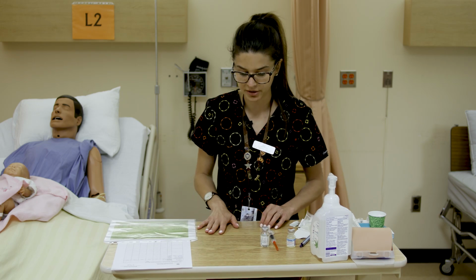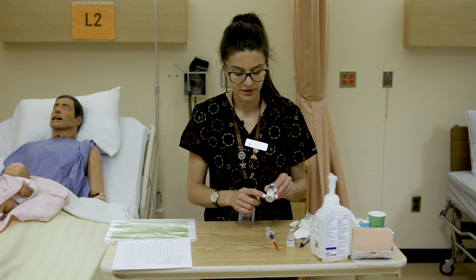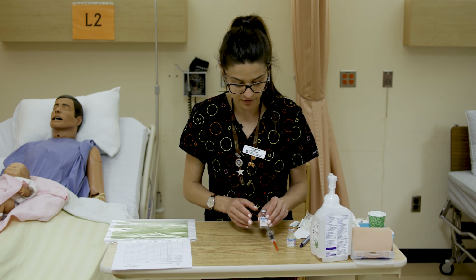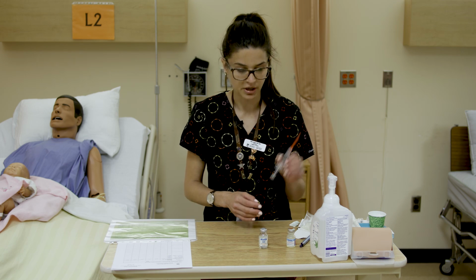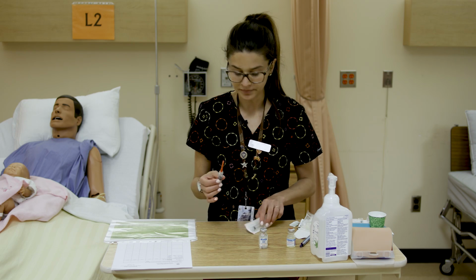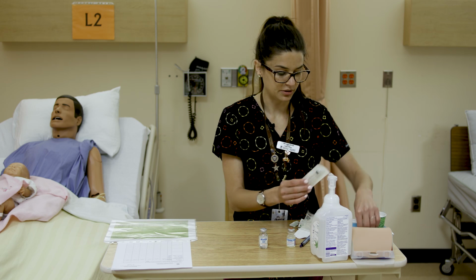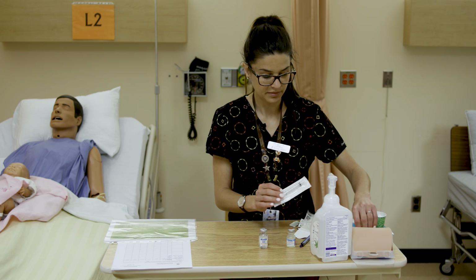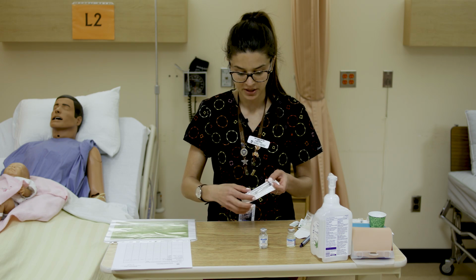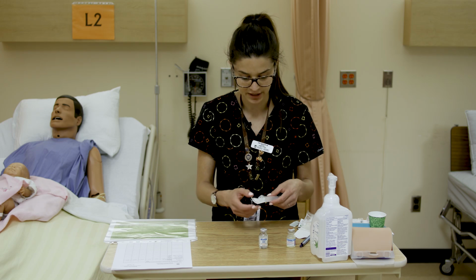What we read on our monograph, if you remember, is once this is all diluted, it's 250 milligrams per ml in here once it's diluted, like I said. So for our 500 milligrams, we're going to need to draw up 2 mLs. We could use this syringe again, this 5 ml. Or we could use a new syringe and a new blunt fill needle. So I'll just get a blunt fill and we'll use a 3 ml syringe so you can see more typically because this is what you have in your kit as well.